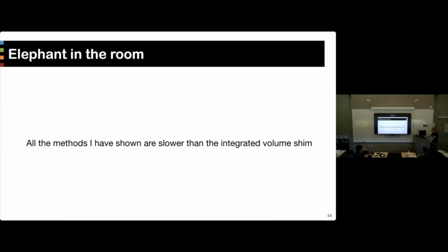You need to make sure you're in the right folder, on your terminal, and then you take it back. You need to take your text file and put it at the right spot. So those things take some time.